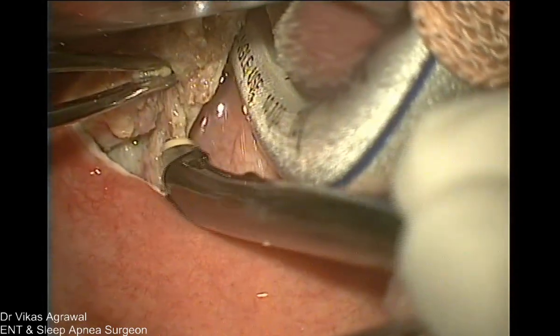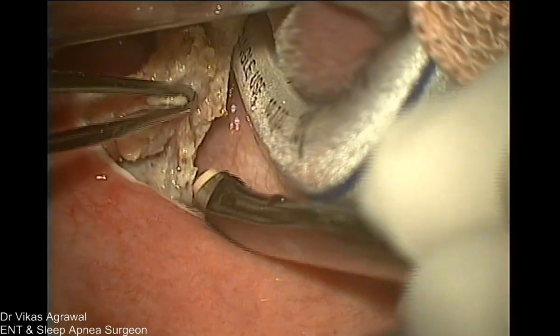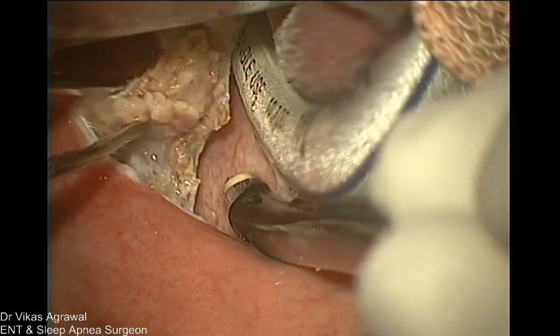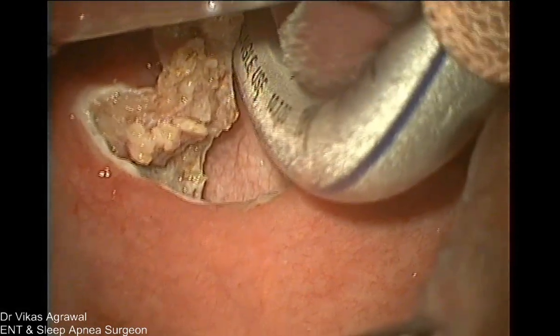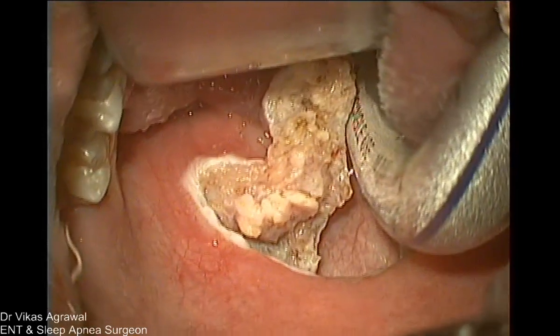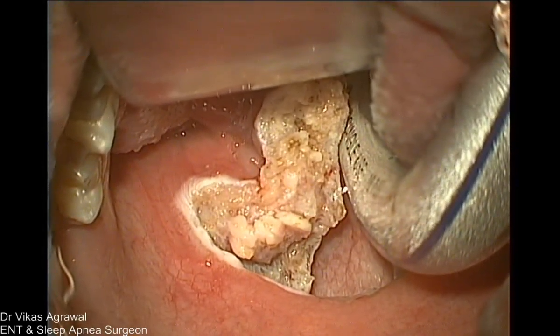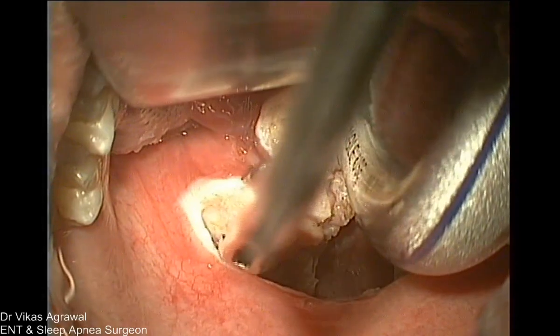So this is my plane of dissection. When I proceed, this is my plane of dissection. Right. I will not go lateral to it because these are the vertical fibers and they are part of the lateral pharyngeal wall. Now I'll change from a tooth forceps to a... Okay, is it visible? Yeah, seen very well. Now I'll take a lux forceps to hold the tonsil and do a tonsillectomy.